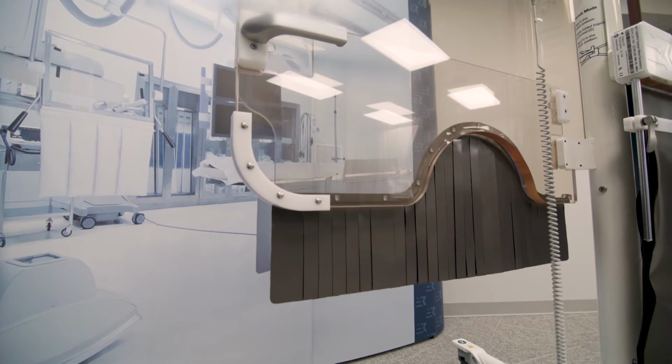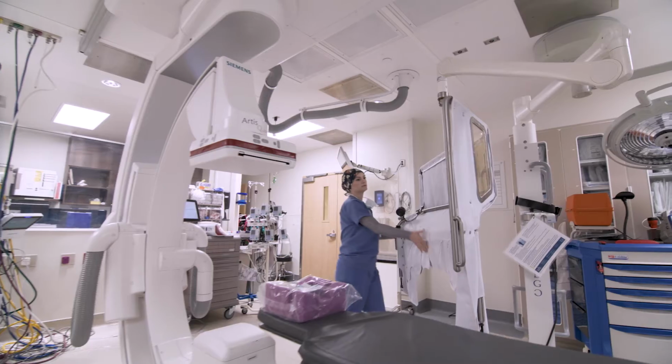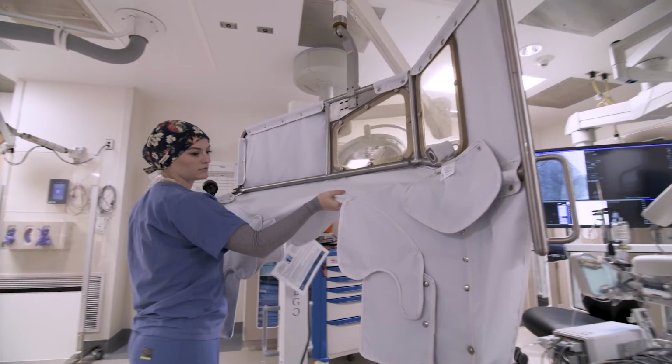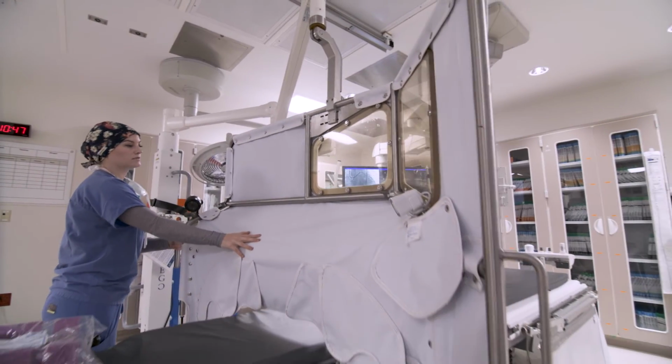I do believe we are just beginning to see newer technologies that are allowing us to create these barriers, and they all have ways to go to continue to perfect them. We need to make sure that they're able to be set up quickly. I think the way that they're set up to make sure that there are no gaps in the radiation is important. And I think as time goes on, there are going to be simple ways and designs that make it so that those gaps are automatically covered.